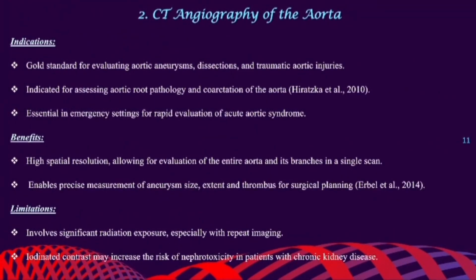Secondly, we have CT angiography of the aorta. CT angiography of the aorta is the gold standard for evaluating aortic aneurysms, dissections, and traumatic aortic injuries.